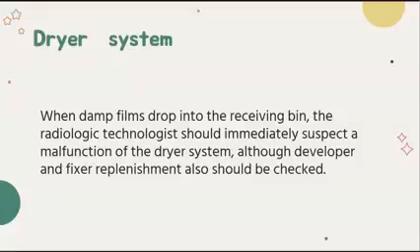And of course, third is the depletion of the hardener, or the glutaraldehyde, from each processing tank, the developer and the fixer. Under replenishment reduces the concentration of hardener and is a common cause of damp film. So if your processor chemicals are not replenished well, there is a possibility that the hardener is not concentrated enough, which will cause damp films. Damp films easily pick up particles like dust that could cause artifacts on the radiograph.